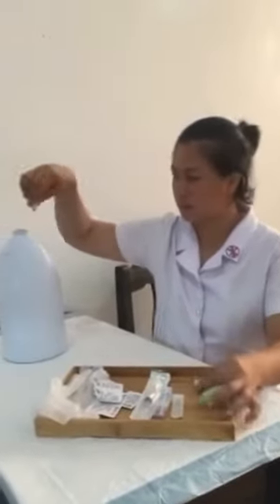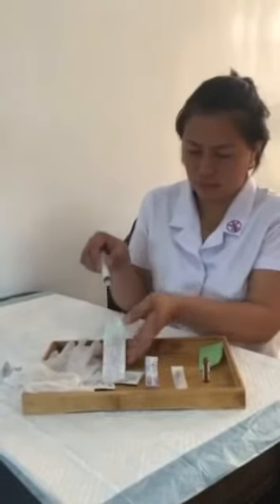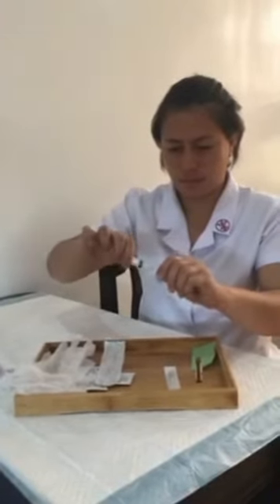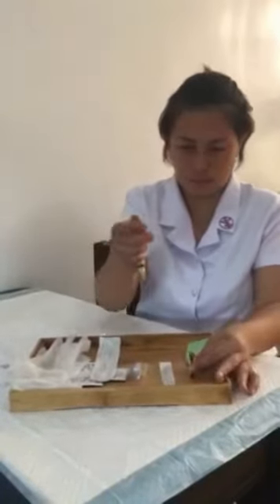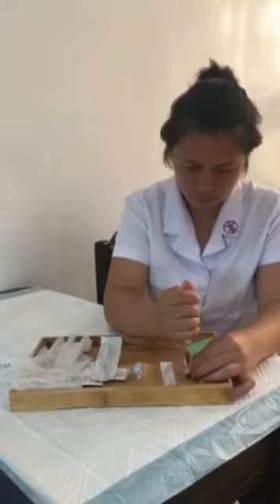Or you can place the antiseptic wipe packet over the top of the ampule before breaking off the top. This method ensures that all glass fragments fall into the packet and reduces the risk of cuts. Dispose of the top of the ampule in the sharps container. To withdraw the medication, place the ampule on a flat surface and attach the filter needle or straw to the syringe. The filter needle prevents glass particles from being withdrawn with the medication.